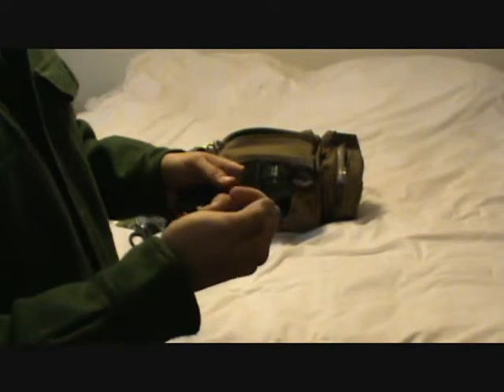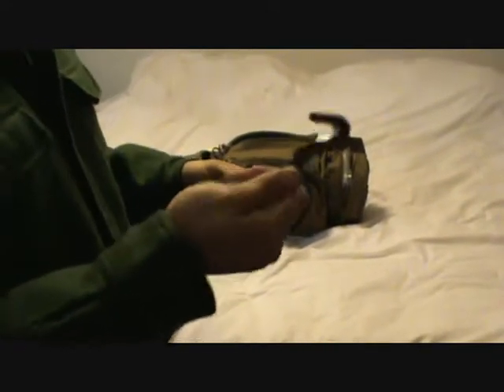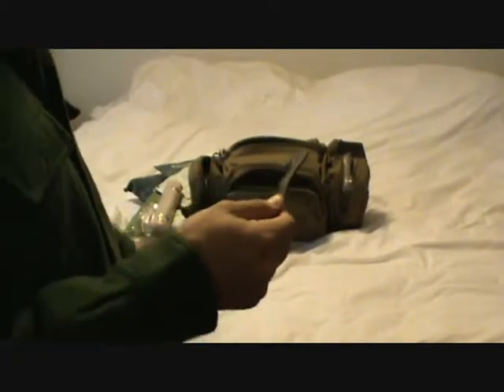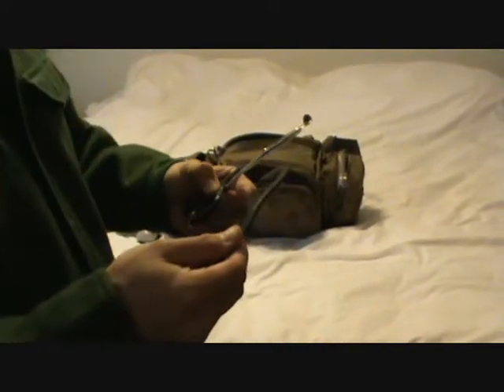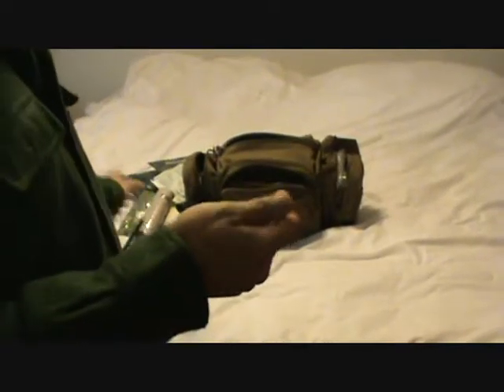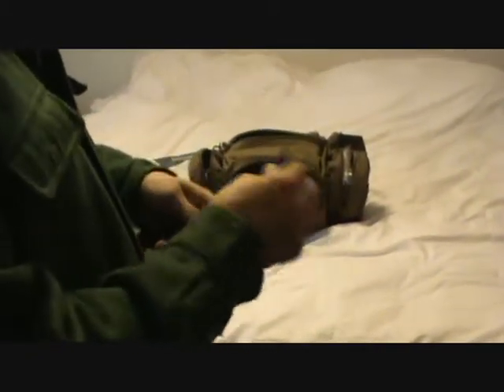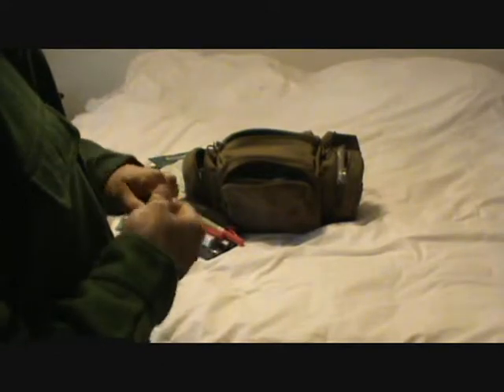A lot of you might think, what do you need a seatbelt cutter for? Well, a seatbelt to start with, and the clothes of somebody. I did show you these shears, but it just might be appropriate to hook this onto, for instance, here, and rip down, or someone's pockets, someone's belt, and just rip it off if need be. And this is what that product is for. Actually does a really good job. So these are some of the things that I carry with me.